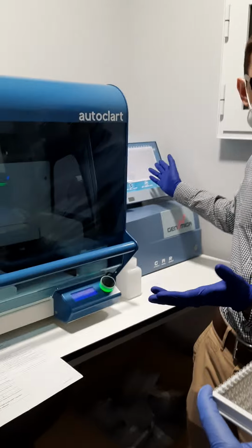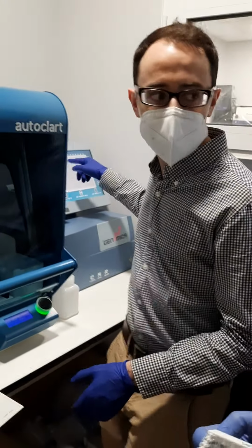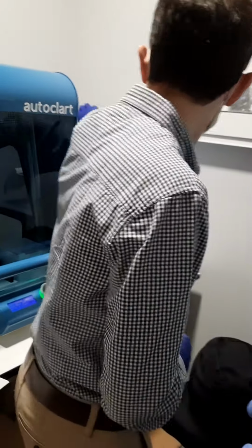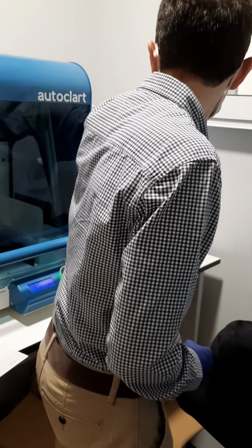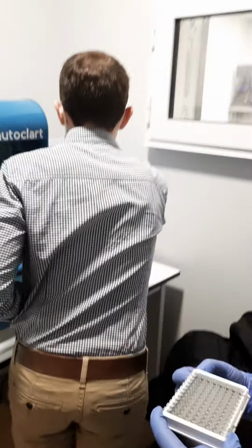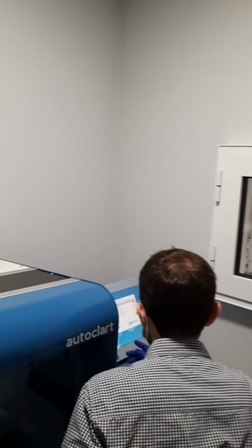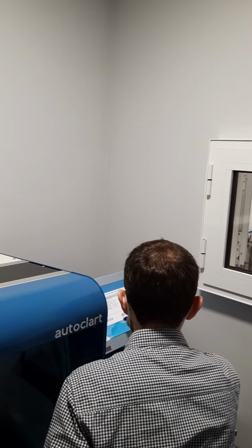We have a representation of the plate. We are going to read this 8, for example. We select which one it will read. If we press 2 times, here we select the software that we want to read. Imagine that we select HPV4.